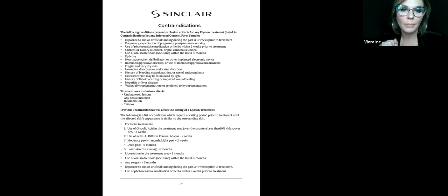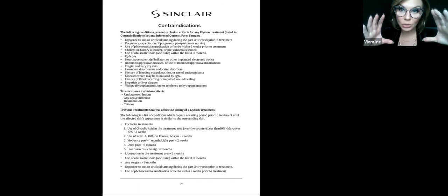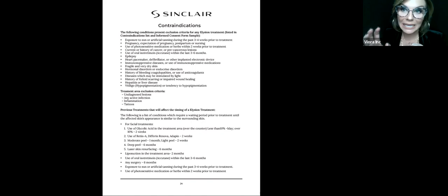Tattoos, be very careful. If they have a huge tattoo and they want hair removal around it, you cannot go over a tattoo because the metal and the ink will pull that laser light in. It will create blisters and burns and destroy their tattoo and can create scarring on them. It's horrible. I've seen it happen within the industry.